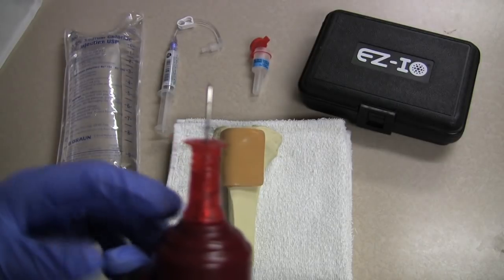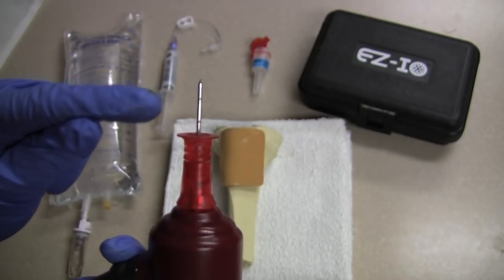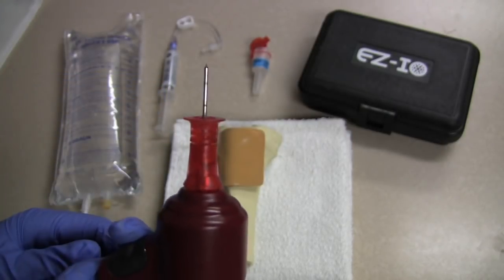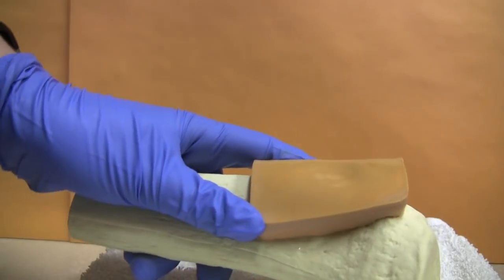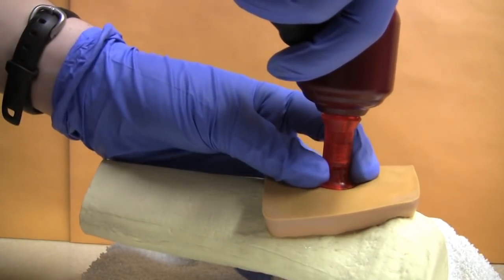Now you notice there are two lines on the needle. The line that is closest to the point, you don't want to pass that when you first put the needle in. So I am putting it in — it does not pass the line. Drilling. It is going straight in.